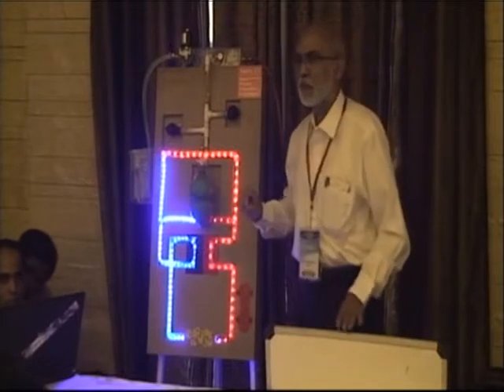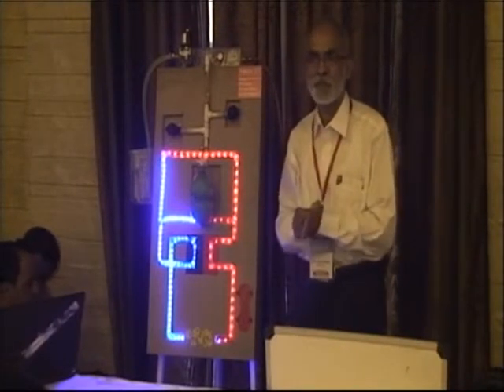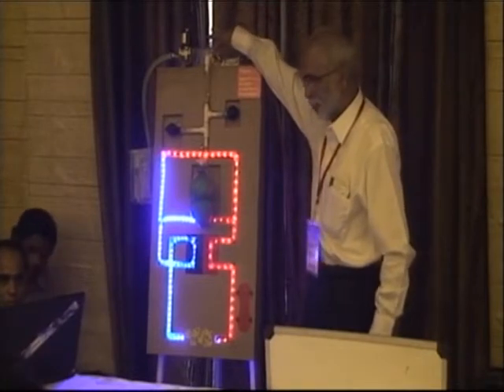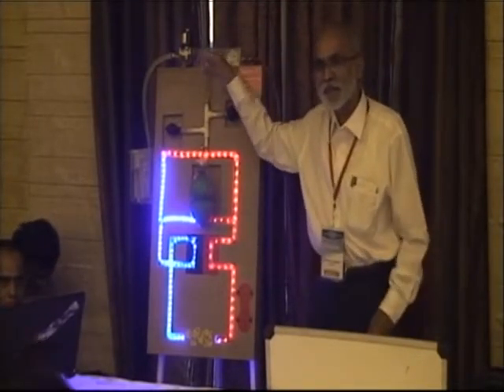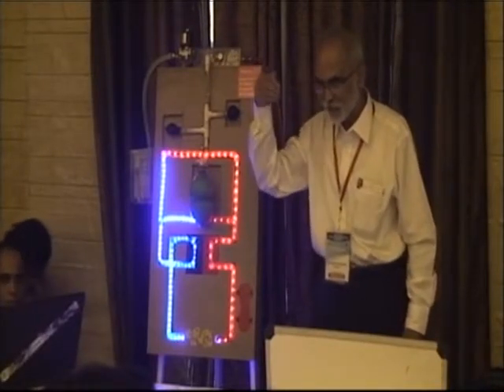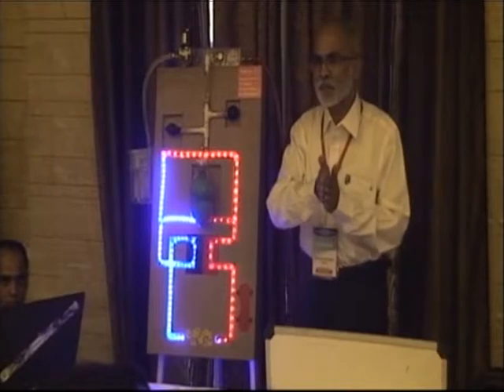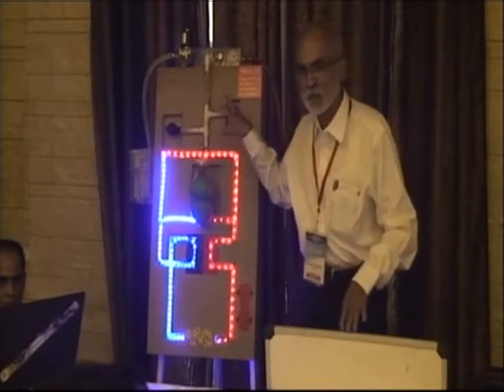Like we have tried to develop a different sensor, like we have flow sensors which are very costly. What we have done is we put a fan here. This fan moves depending on the speed with which the air comes and goes in, and that speed is taken by a sensor and put on a Microsoft Access file at about 1 millisecond rate, and we develop a graph, which is a cheaper way of developing the graph coming from this.